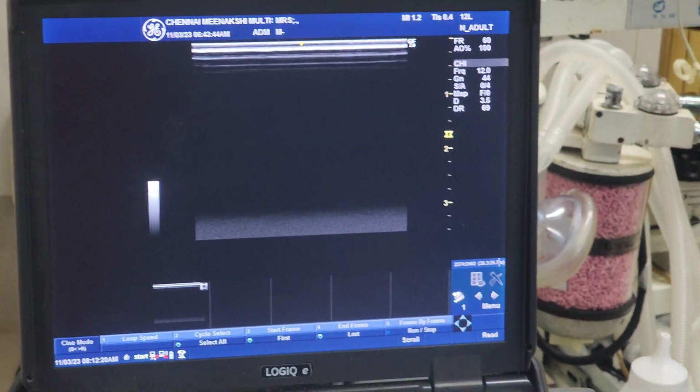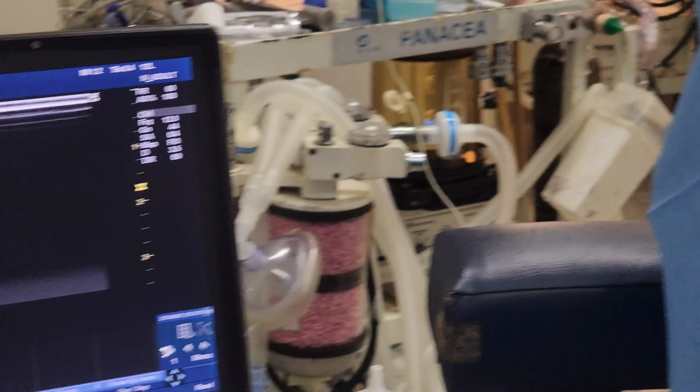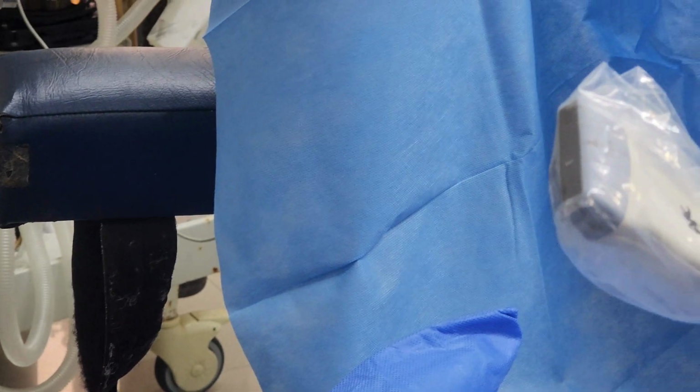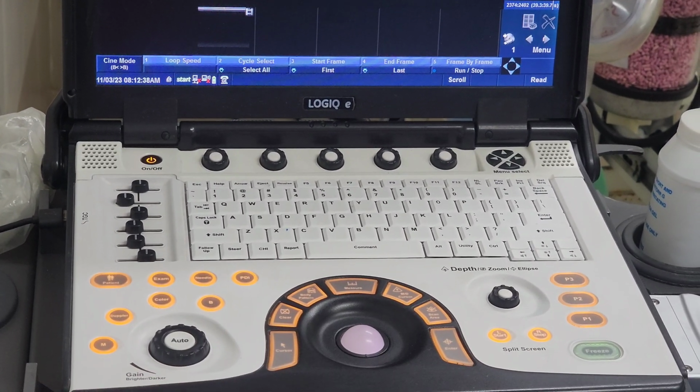So this is the ultrasound machine, and we will be scanning the leg with this probe. This is a linear probe, 12 megahertz frequency. Again, it has been set to the correct degree, and the focal points have been set to 1. You can see that yellow one there.